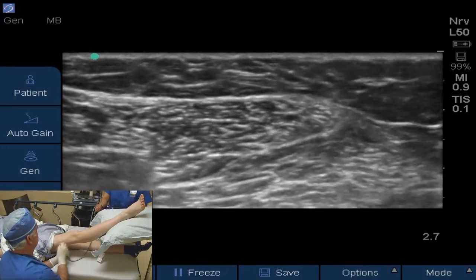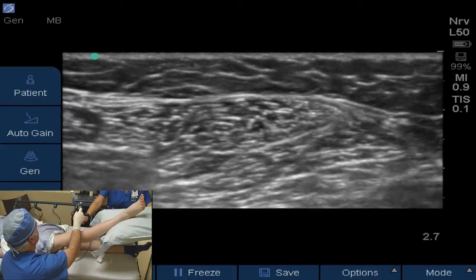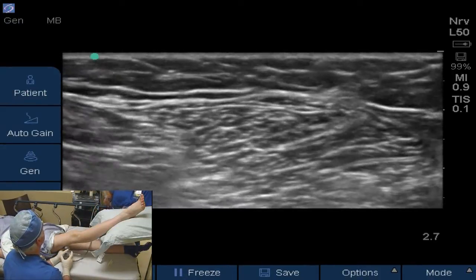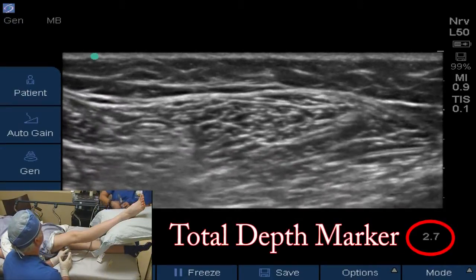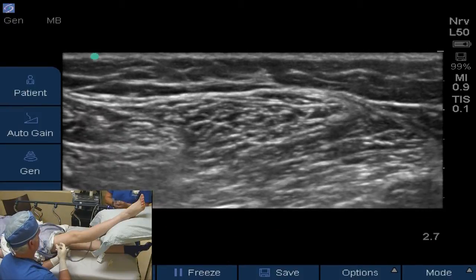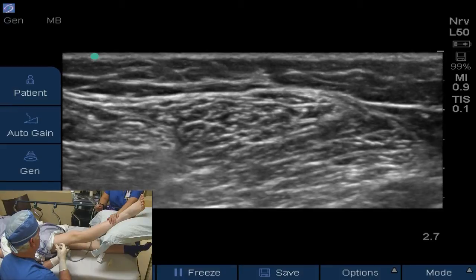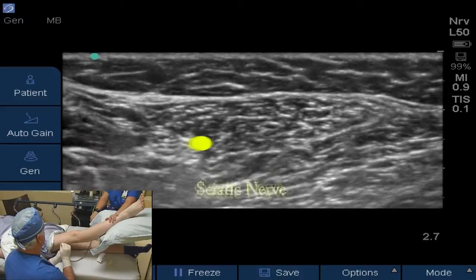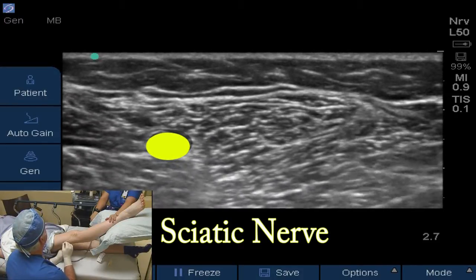We'll take some chlorhexidine and do a nice prep here and put some local in. We can tell her nerves are also fairly superficial — they're only about a centimeter to a centimeter and a half deep. So we're going to approximate that with this local and go in, try to go straight across the screen with the needle, and get the nerves in a really good position so we can see them well.